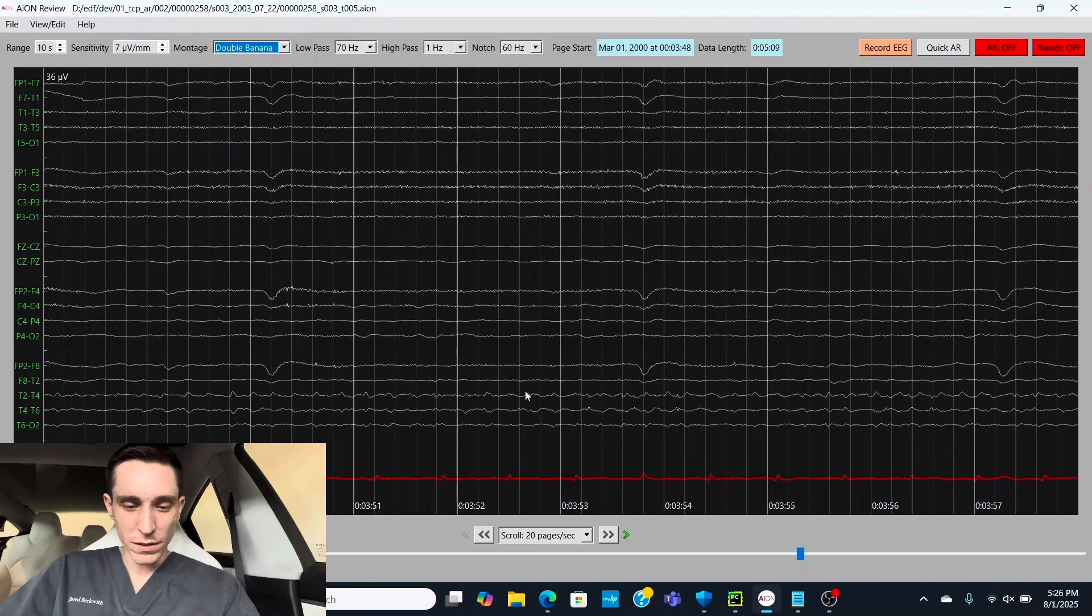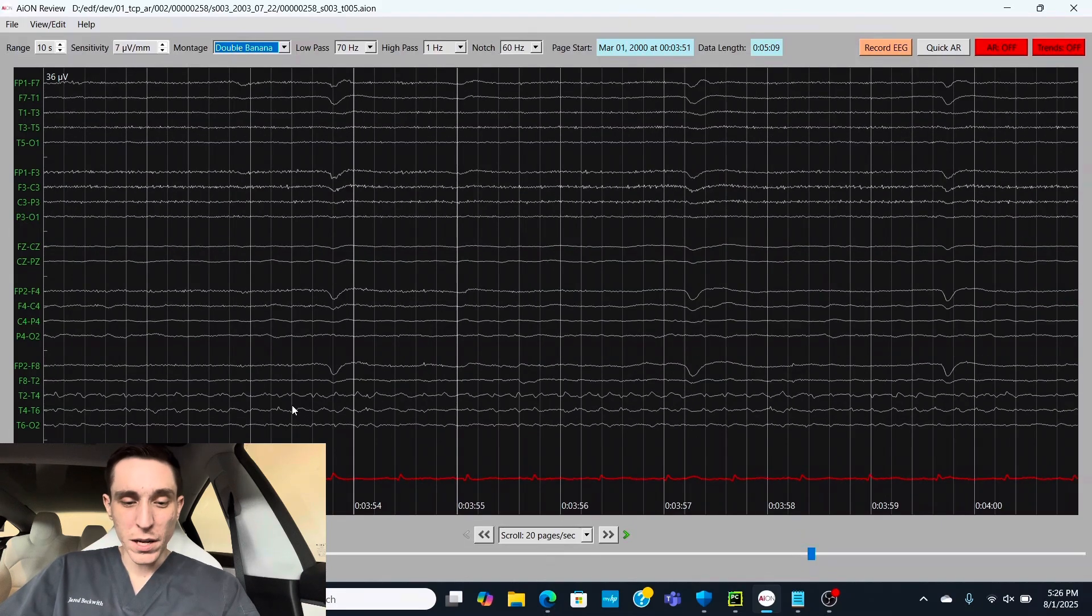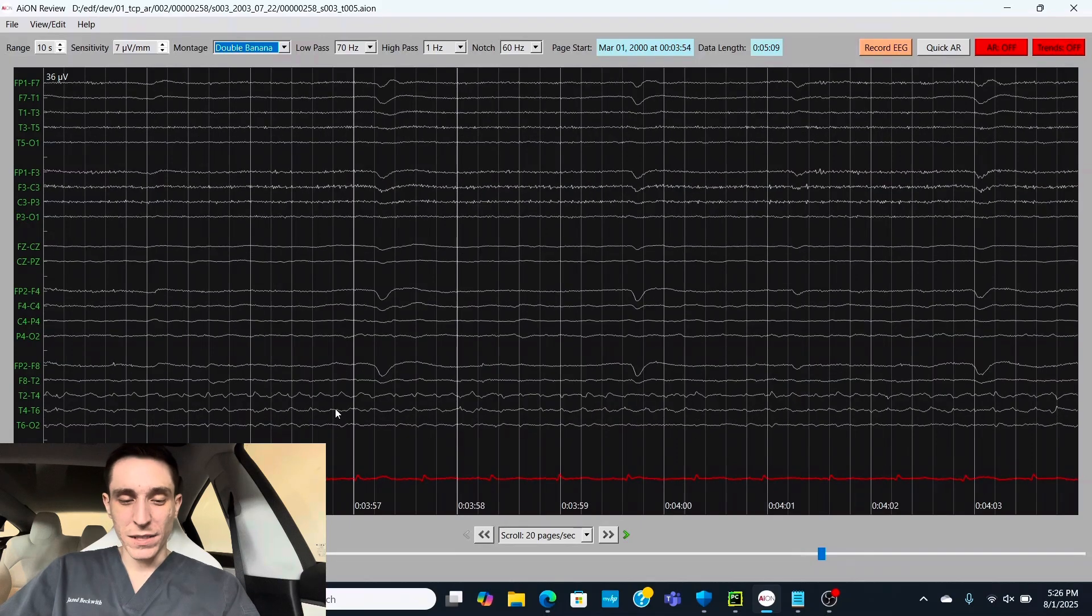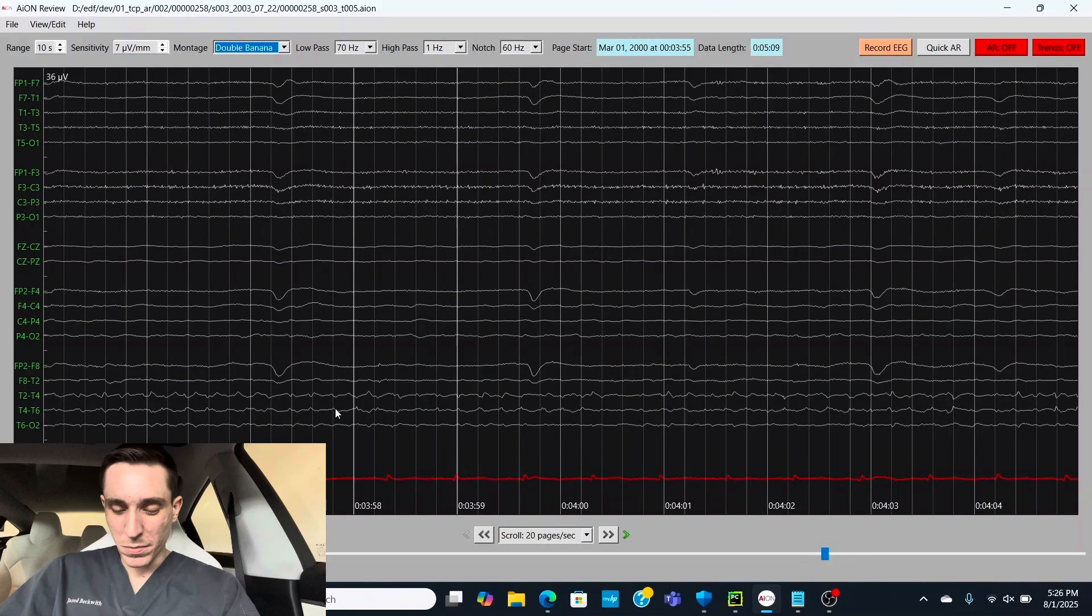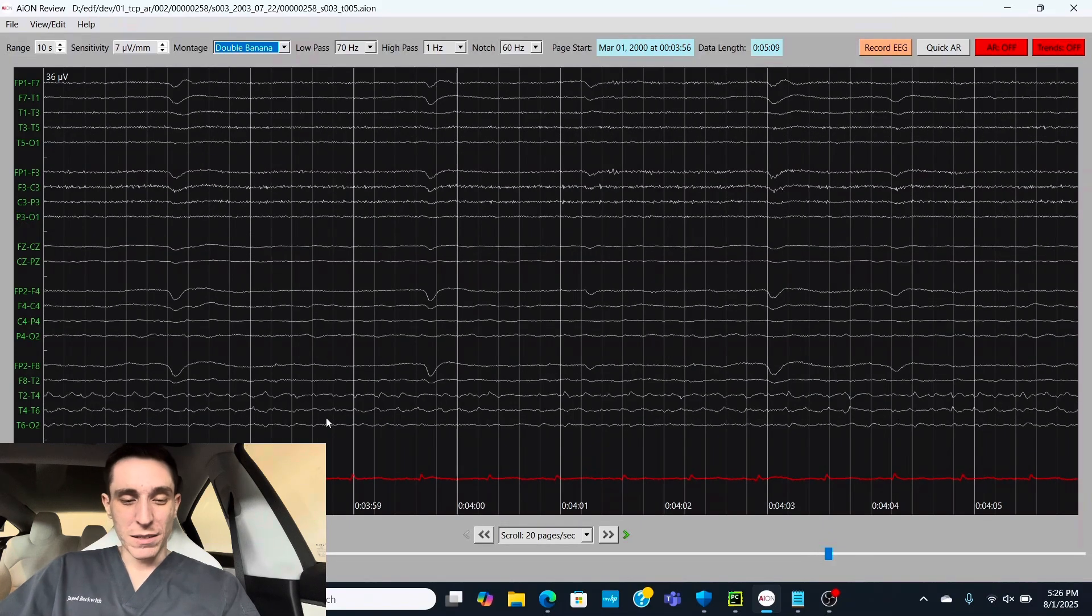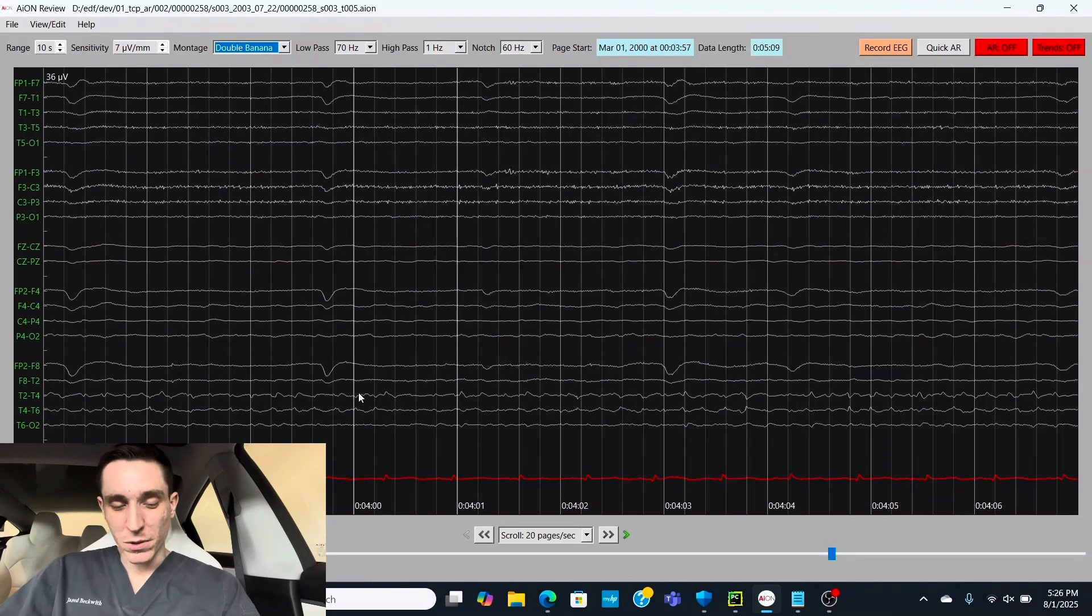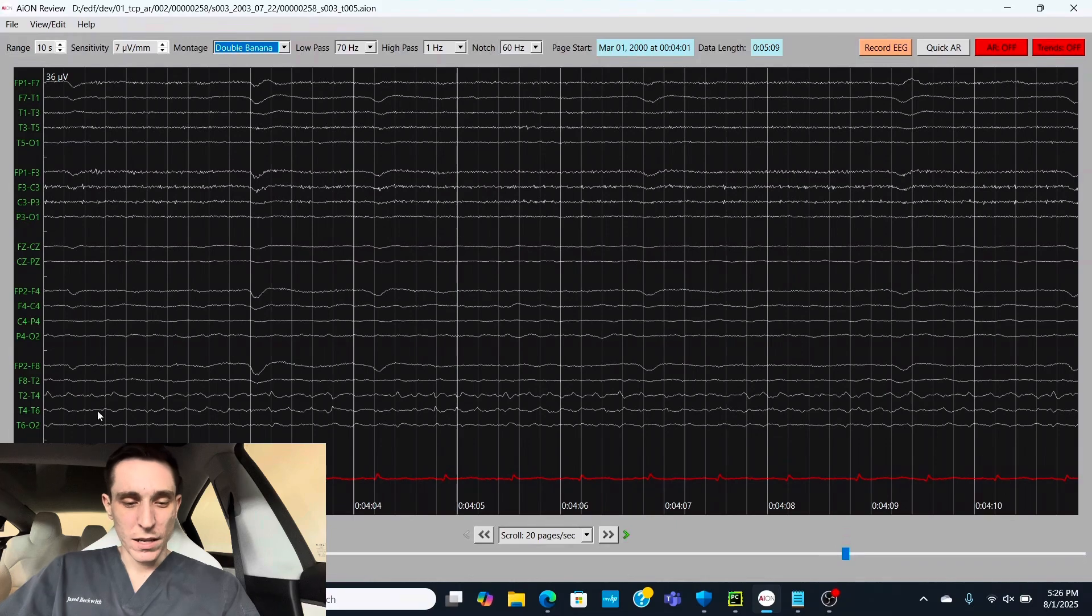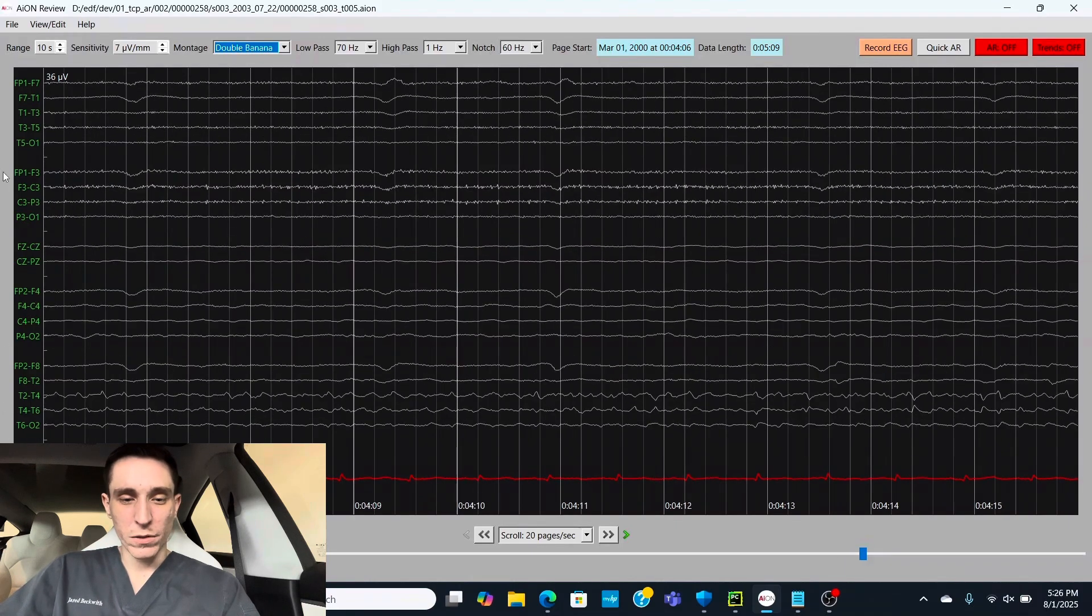We can see it's starting to build up. That's a good sign of a seizure. If something slowly builds up and persists, you can say, oh, that was probably a seizure and not just noise. So we have this spiky activity here in the right temporal region.